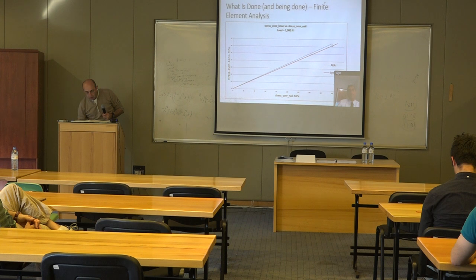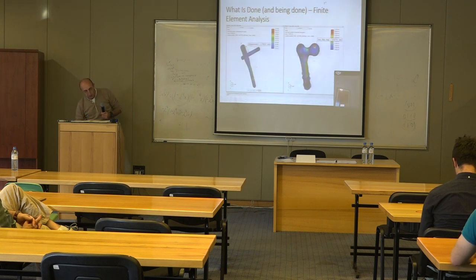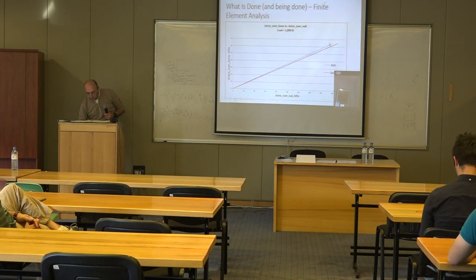One important aspect of comparison is related to the so-called stress shield. The point is that the nail should not be too strong, to take the complete load on itself. Something should be left also to the bone, for the bone not to degrade. In this comparison, the red one is Synthes: the dependence of the stress over the bone on the stress over the nail. This is this relation. And this blue one is ours. So we see that they are close, but this is still underway.